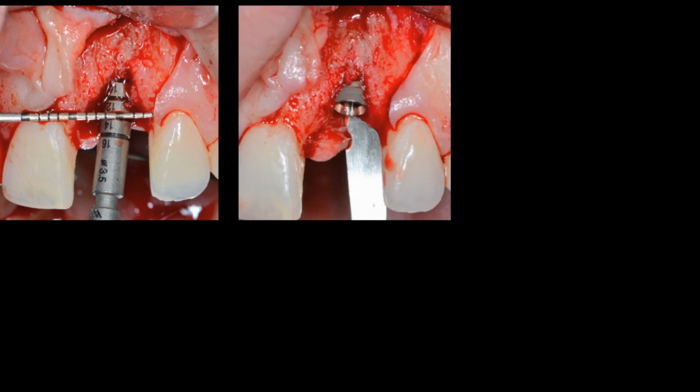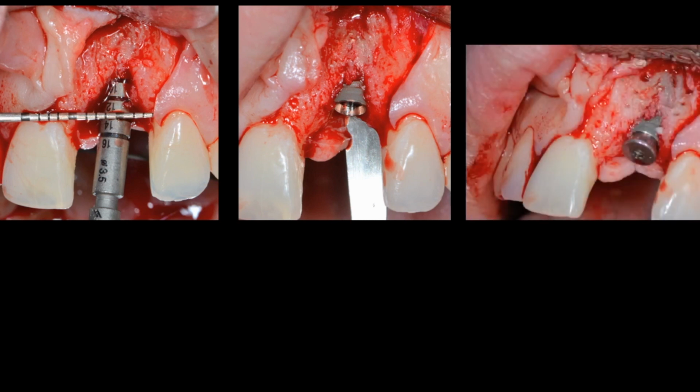The implant was placed accordingly also to the adjacent cemento enamel junction. Here the bone is about 3 millimeters away from this cemento enamel junction, so a bit more, 4 millimeters here. So we placed the implant only 2 millimeters away from the cemento enamel junction, as you can see here. Some of the implant threads were exposed, and we then decorticated the bone, knowing that, of course, we had to graft on top of that implant.